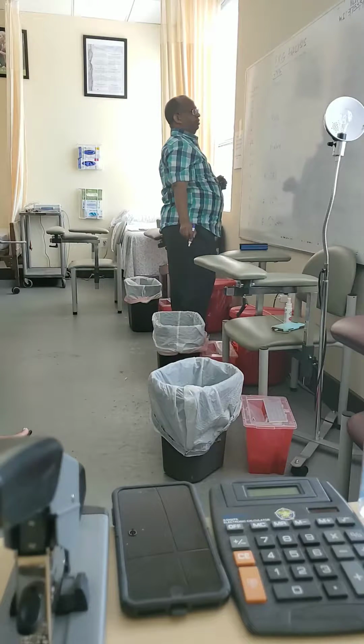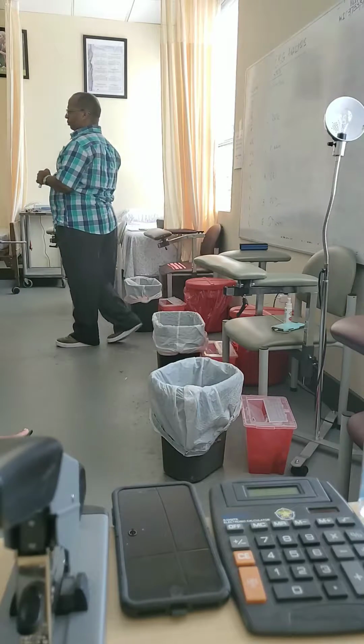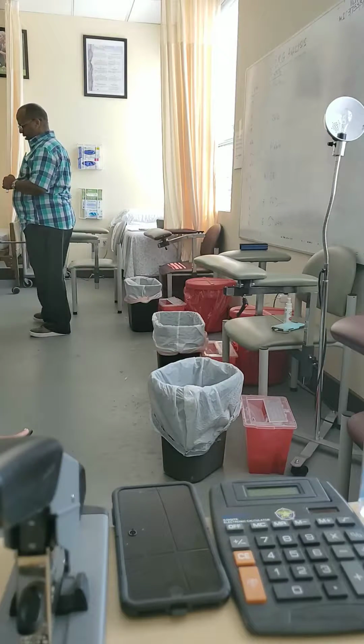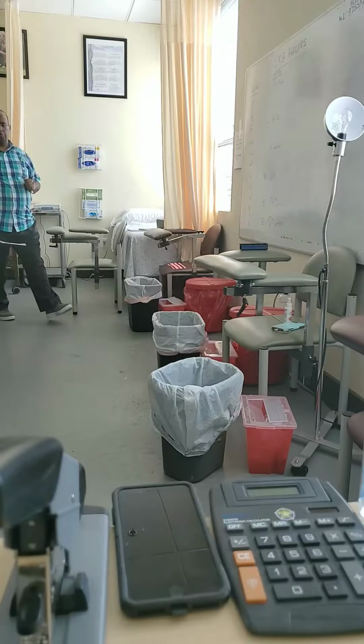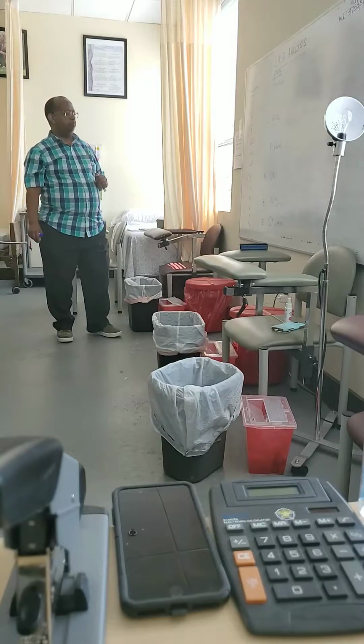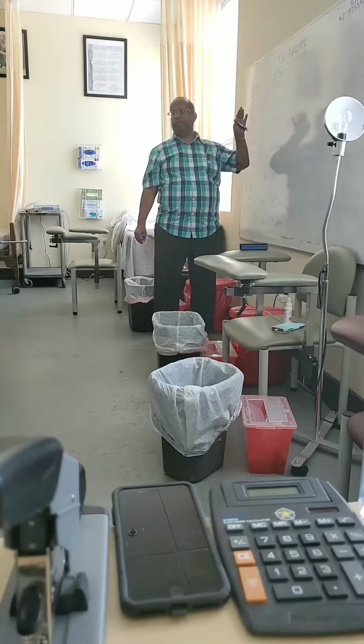Steps of EKG analysis. Do you know what the name of the bus stop is? Can you Google it? What's the name of the bus stop is? So when you switch. On the picture it's like this, Dr. T. Okay. Okay. Now let's go to the rhythm.